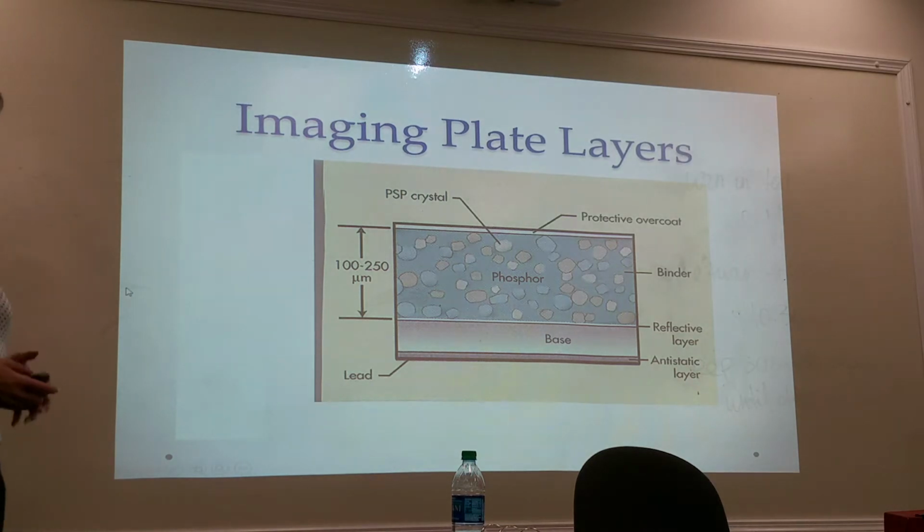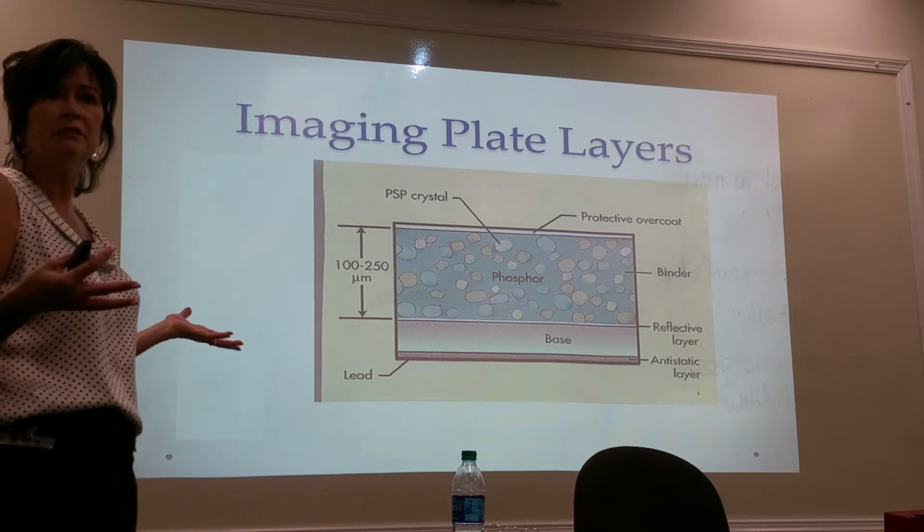So here are the imaging plate layers. I do want you to know this, just like you used to have to know the layers of film, now you need to know that. Is this familiar? Is this coming back to you a little bit from 146?